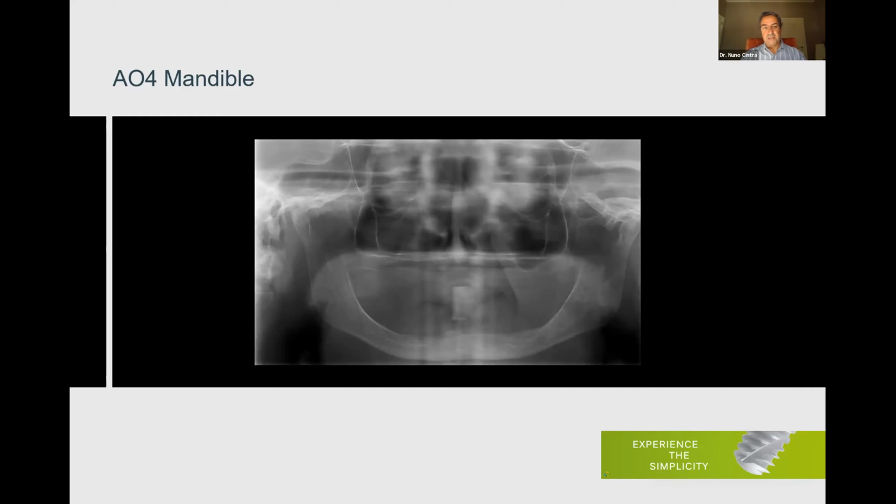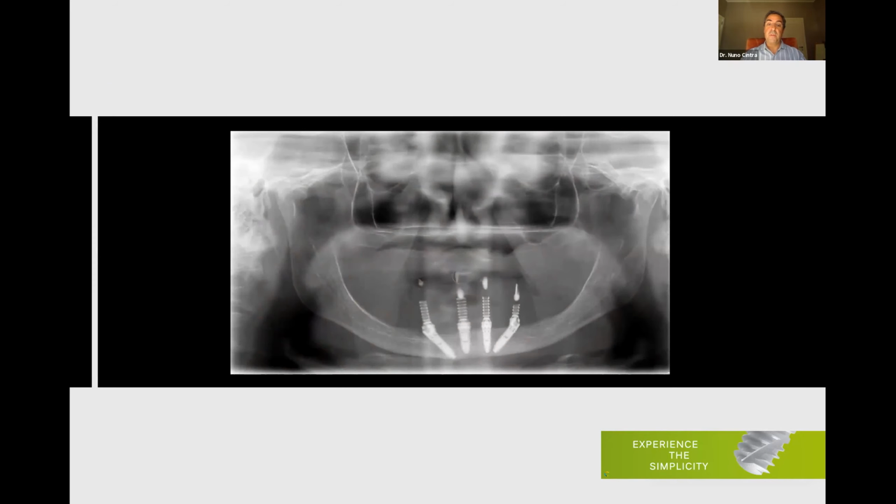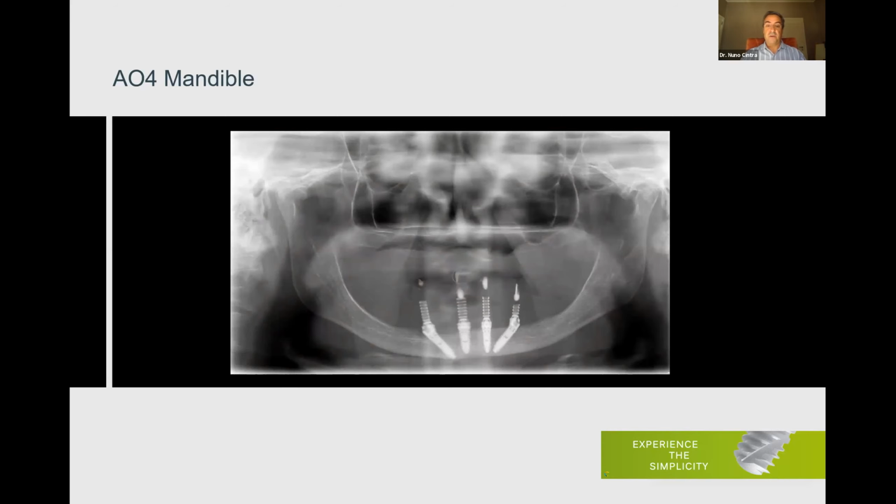Well, remember that study with Branemark in 2001? He concluded that the bone stress is lower if we use longer implants. And that's the only advantage of using an all-on-4 or tilted implants in an atrophic mandible, because we are starting in front of the nerve, like we will do if we use straight implants.